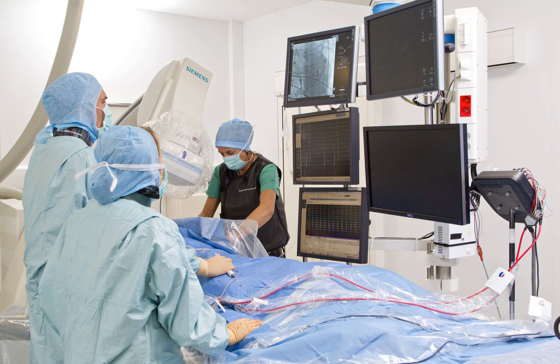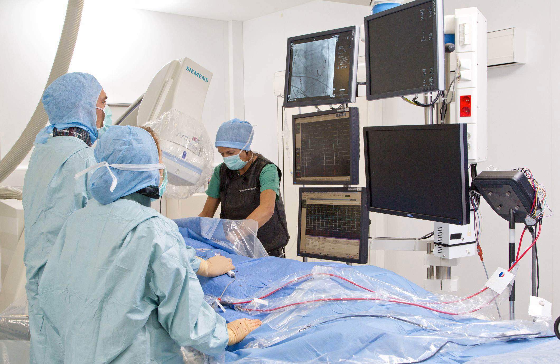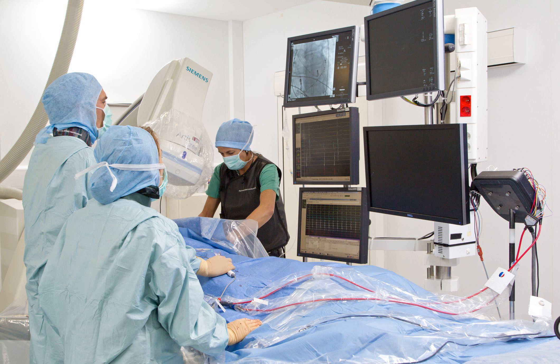An endometrial ablation is less invasive than the cardiac type, but the purpose is still the same. Energy, or some other force, is used to destroy the problem tissue. Compare the steps of a cardiac ablation to an endometrial ablation below.